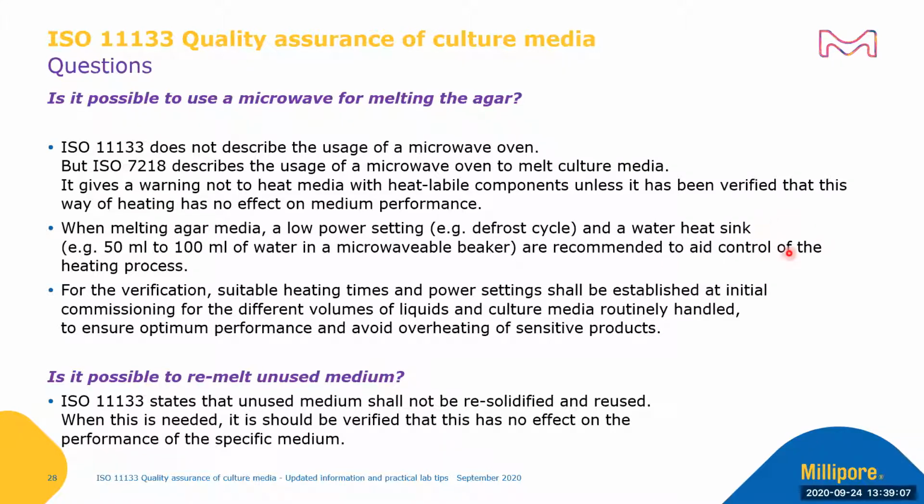This is recommended to aid the control of the process. For the verification, suitable heating times and power settings shall be established at initial commissioning for the different volumes of liquids and culture media routinely handled to ensure optimum performance and avoid overheating of sensitive products.